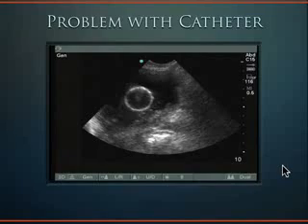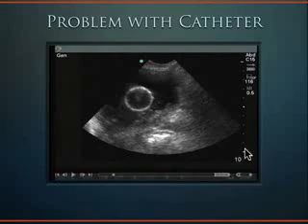And so we said the next step is to just change the Foley catheter, right? So we go to take this Foley out. First thing we need to do is take the balloon down. But guess what? The balloon won't go down. The port that you hook up the syringe to deflate the balloon, it's not working. And the patient is getting more and more agitated because his bladder's filling up. And he's like, hey, doc, get this thing out of me before I yank it out myself.